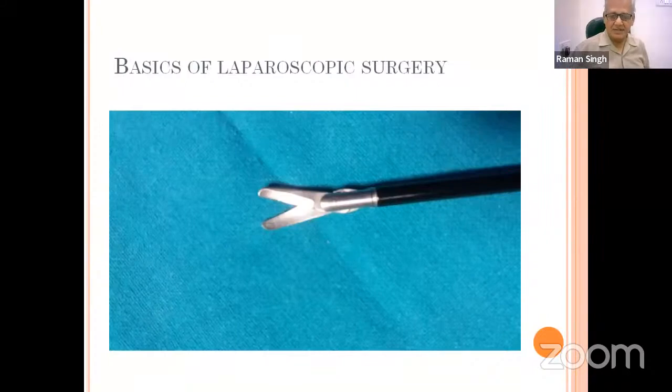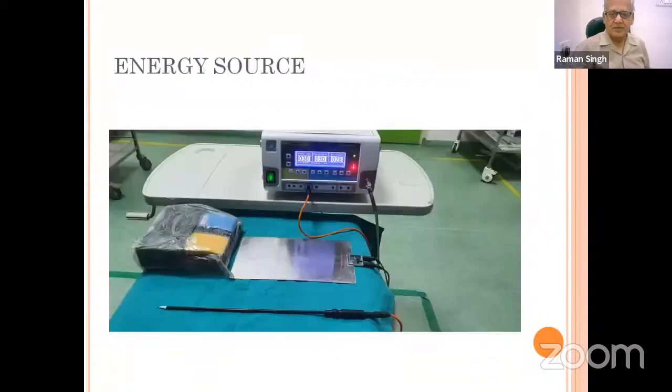And after cutting the cystic duct, then we use the hook cautery. This is the hook cautery. From this side, the cable is attached to the cautery machine. And this is the working end, and it is curved, it is a hook. The corner of the hook is used for the coagulation of the structure, and the tip is used for cutting. This instrument is also called the L-hook.